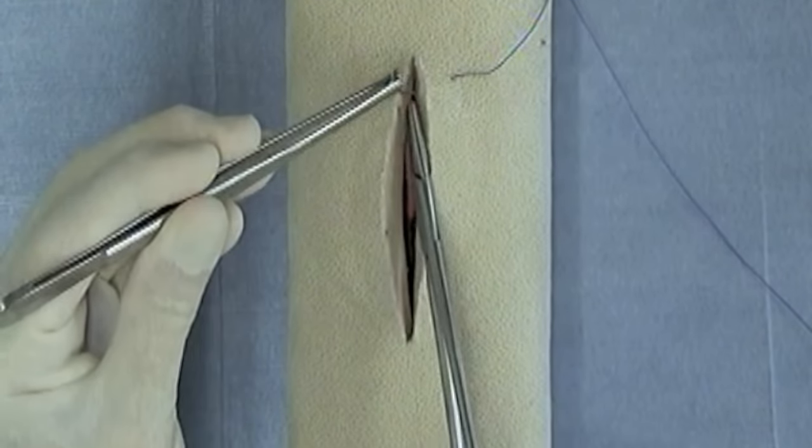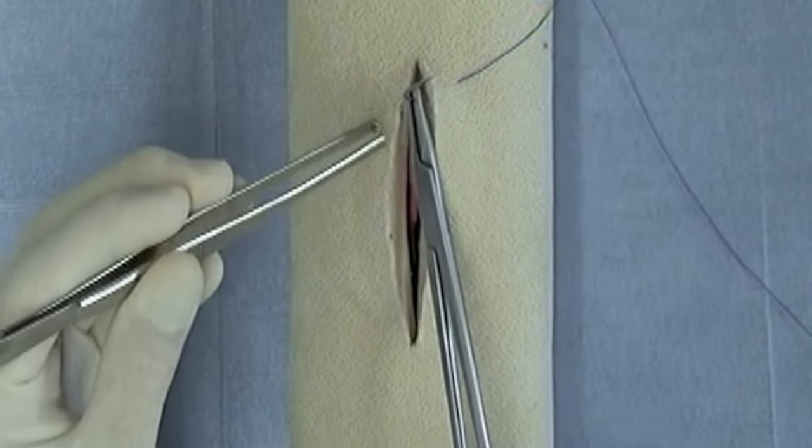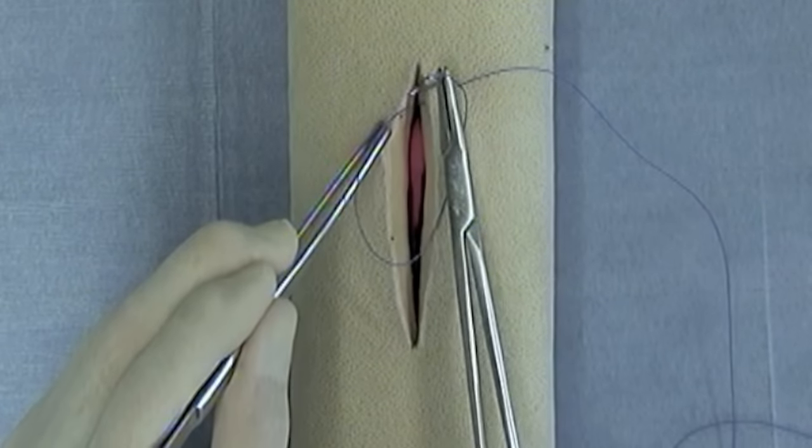You grasp the needle, reset your needle holders, and you're ready for completion of the first bite.